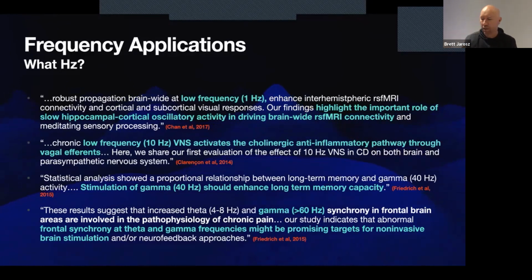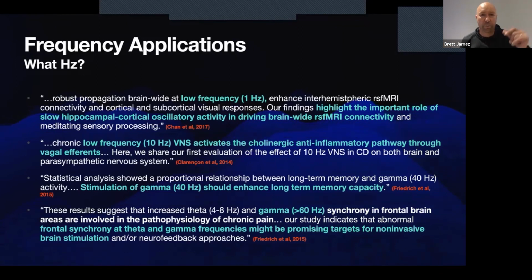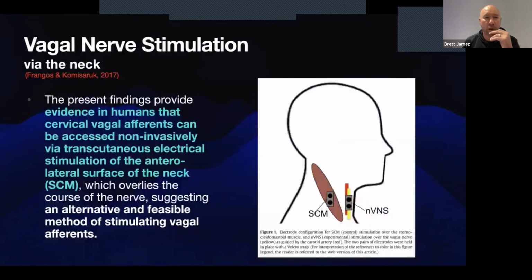So it's the pulsing of the light. Just to share that one with you again, so you guys can see, if I put that on my face here, hopefully you can see how that violet light is going to go 1 hertz there, 10 hertz now. 1 hertz, 10 hertz. Obviously, you can't really see the difference between the 40 and the 60 on the red, because that's 40 flashes in a second and 60 flashes in a second. So it's moving quicker than the visible eye can see.